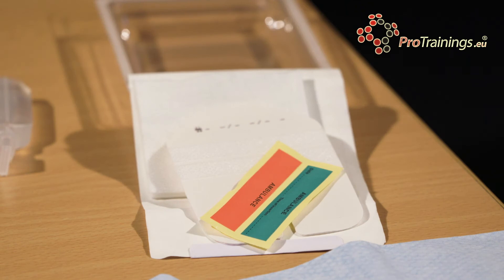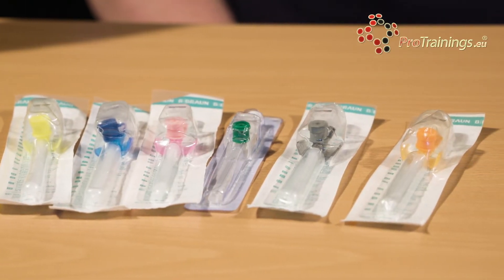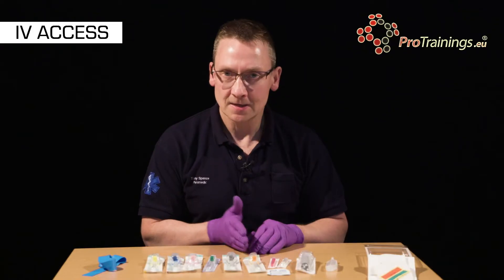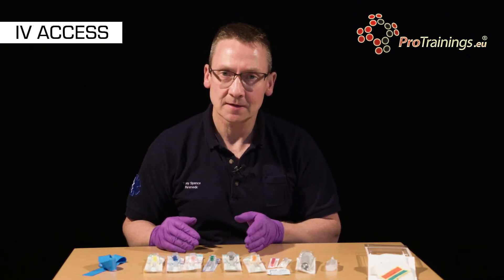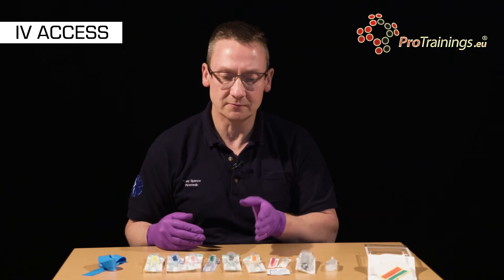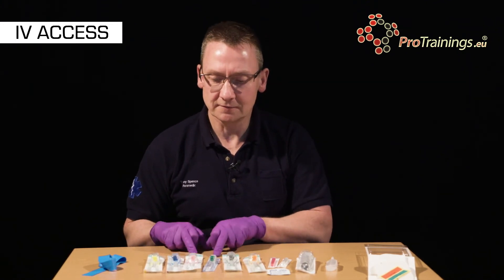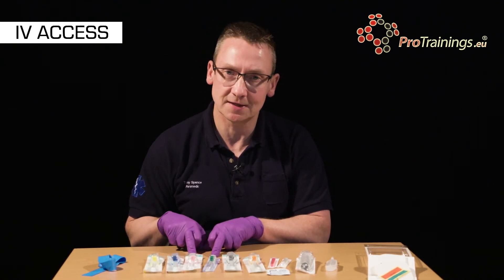Our cannulas come in a range of different sizes starting at 24, 22, 20, 18, 16, and 14 gauge. Essentially the smaller the number the bigger the cannula. For fluids, or when we need to give fluids in a rush into a big vein, we would use a 16 or a 14 gauge cannula. Generally for drug administration we would use an 18 or a 20 gauge cannula.